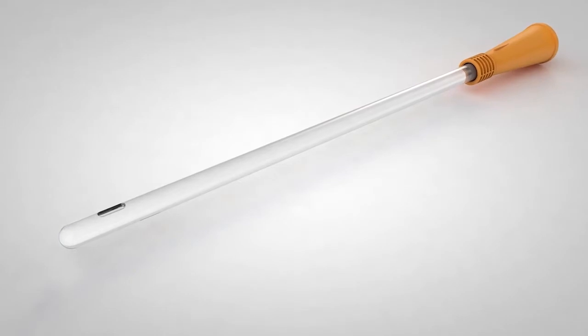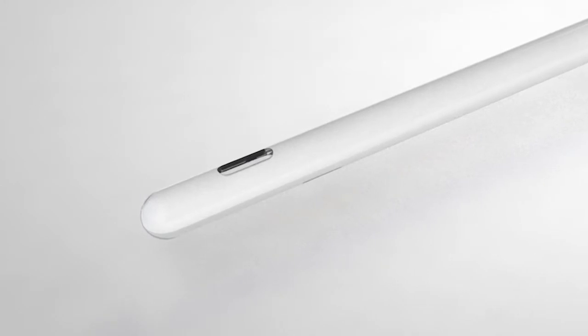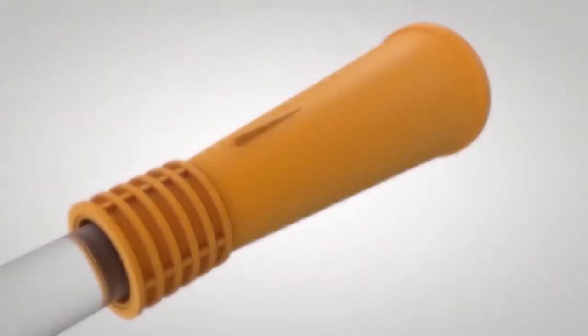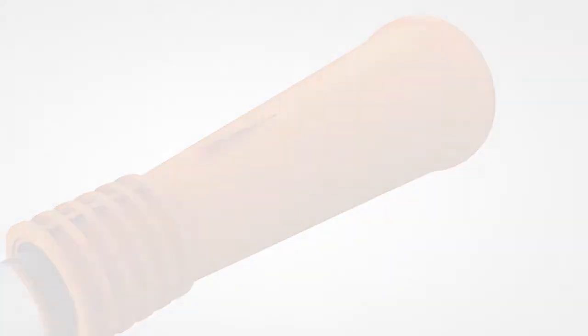The catheter you're using is the GentleCath Intermittent Catheter. It has a soft and rounded tip, and the eyelets are rounded and polished. This helps to make the insertion and removal smooth and gentle. If you're using a coude tip, you'll notice a mark or raised fin at the end of your catheter. This is so you can see which way the tip is pointing. This will be explained in more detail later.